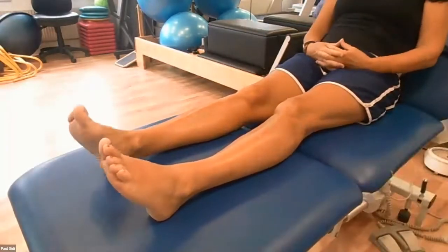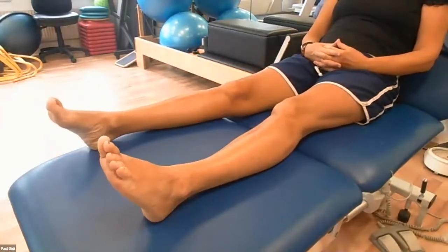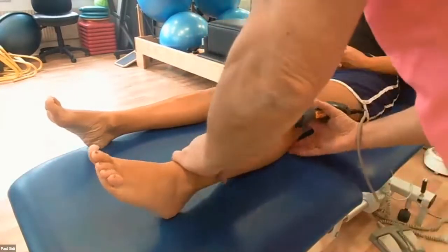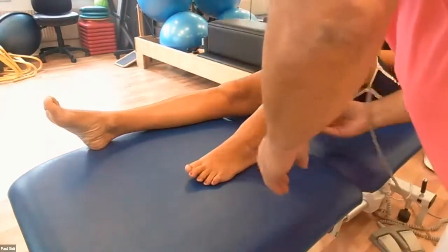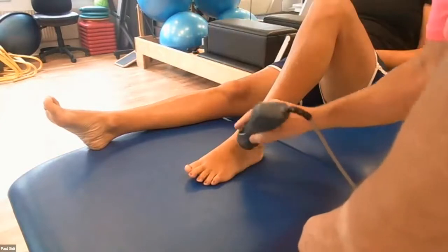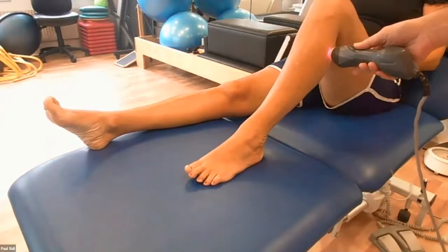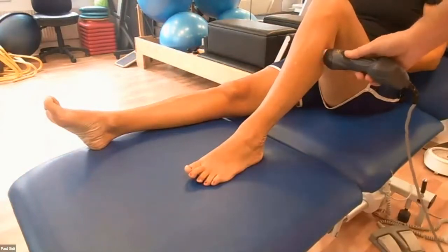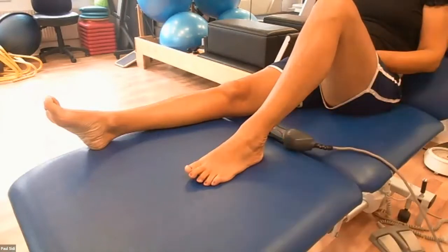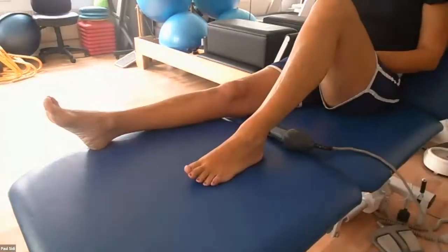She's got bad arthritis in the left foot. I'm going to get her to bend this knee up here, so I can actually get in all these areas on the back as well. Just looking at it, I'm going to get down here, cross here, right through here. Right, what we do is we literally just start it. Can you see this is on? Actually, let me just stop it. I'll turn the lights off. This should make a nice picture.